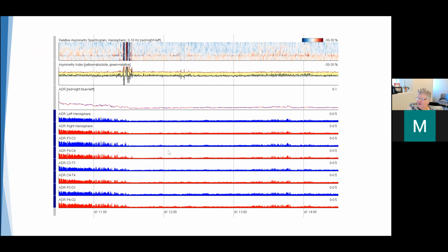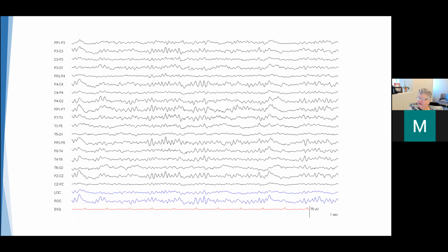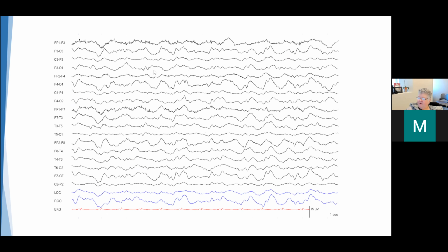When the rapid AFib was controlled and perfusion was restored, the alpha delta ratio improved slightly globally. And here was the raw EEG at baseline, and then the diffuse background slowing when the patient was ischemic.